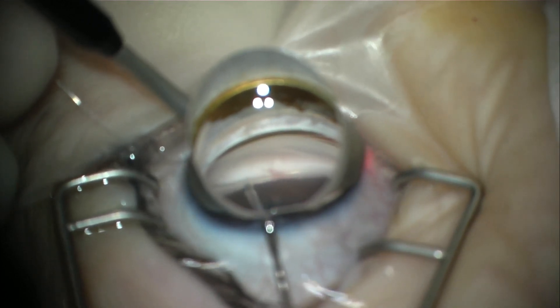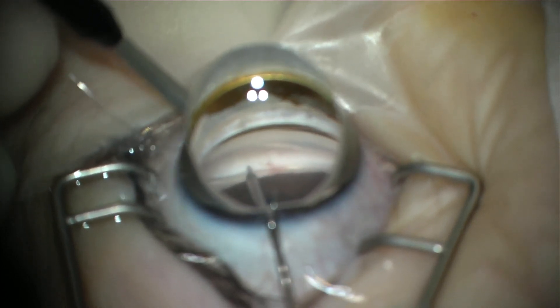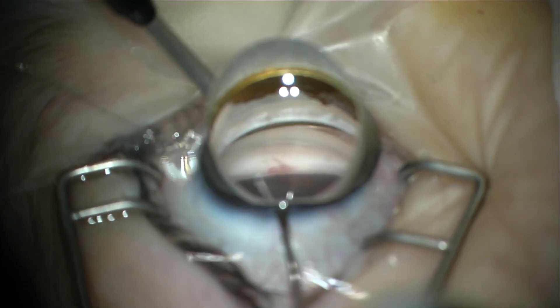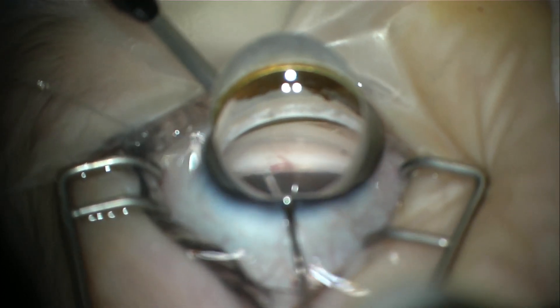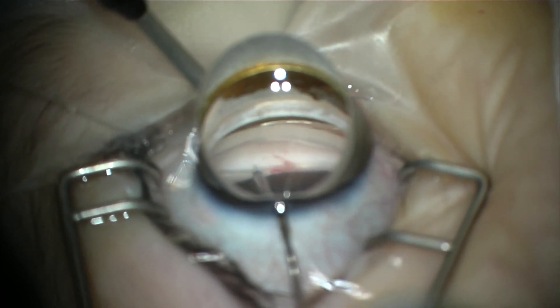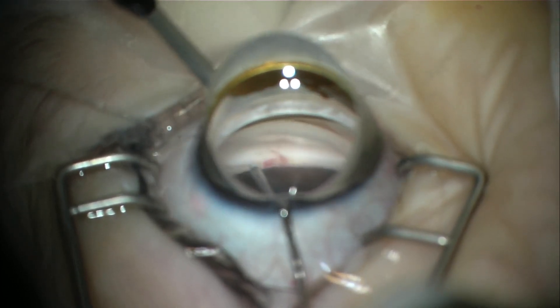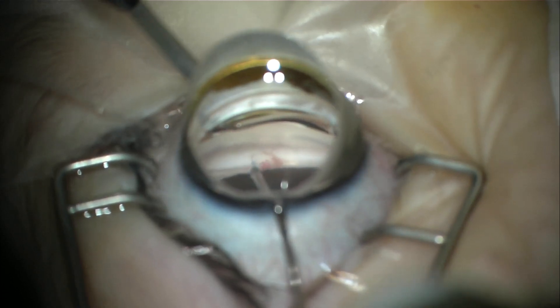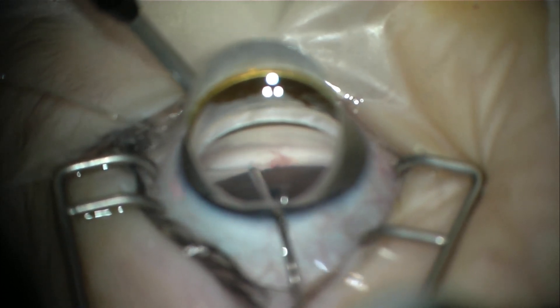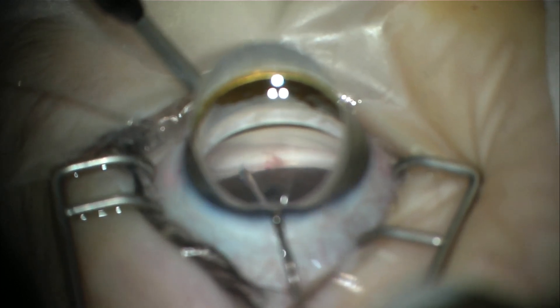Slow, steady advancement in short segments with each grasp, monitoring the lighted tip of the microcatheter as it advances around. We're about three-quarters of the way around now, so it will soon be approaching our original incision through the trabecular meshwork.